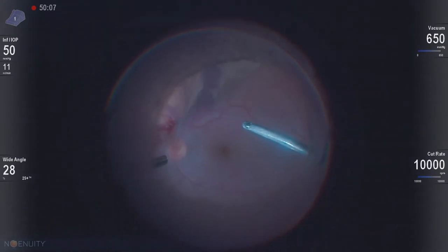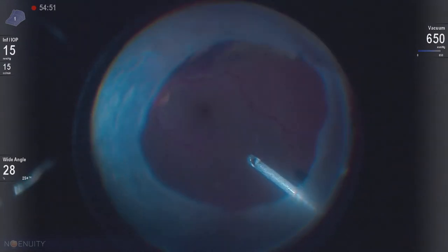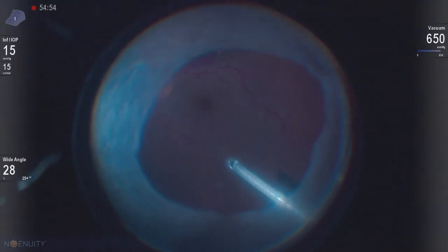This is his second surgery. We've done a primary surgery when the vitreous hemorrhage broke through. We think perhaps it's a polypoidal variant, although really we've been unable to identify the polyps on ICG or fluorescein angiography.